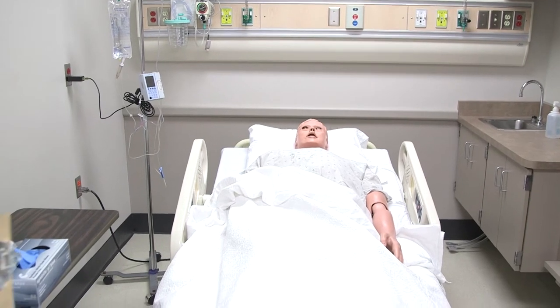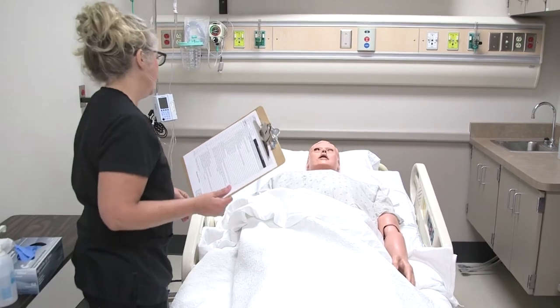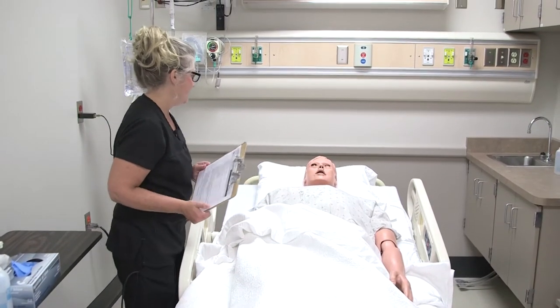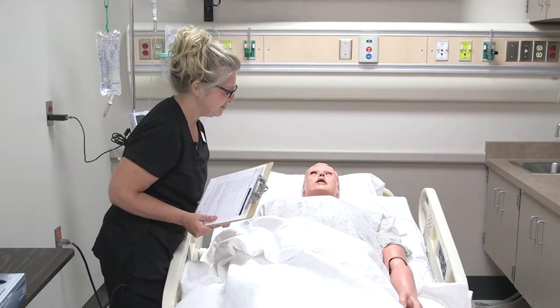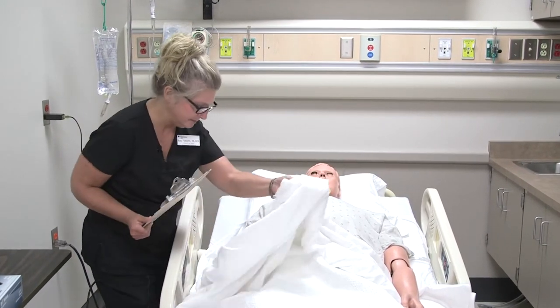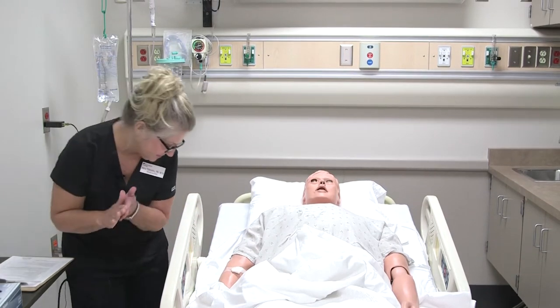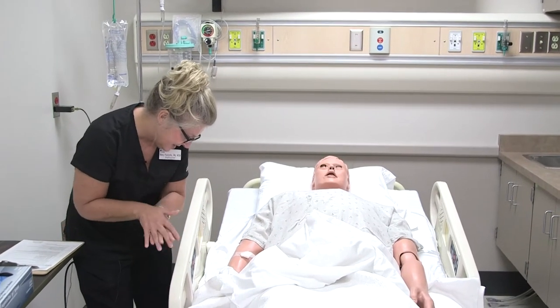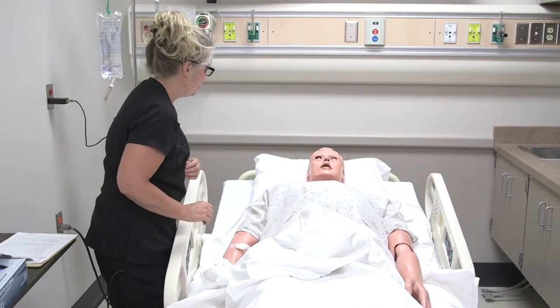Come in. Hello. Good afternoon, Tim. My name is Mary, and I am a student nurse with CVTC Technical College. May I have your full name, first name, and date of birth, please? Tim Pametlo, 7/10/64. Okay. Looking good. It matches my chart here.